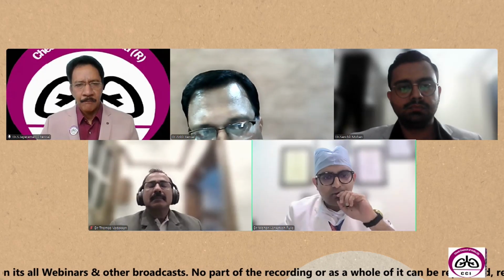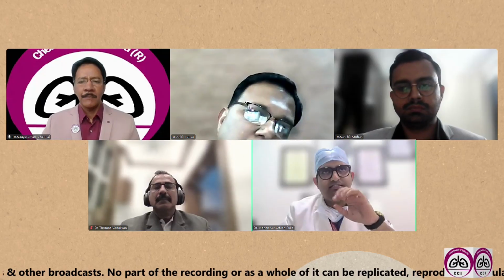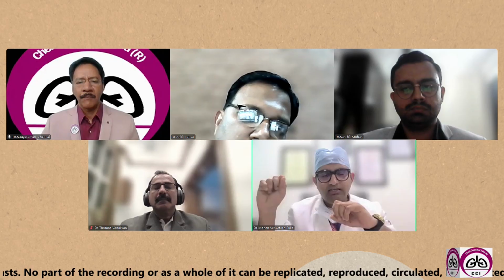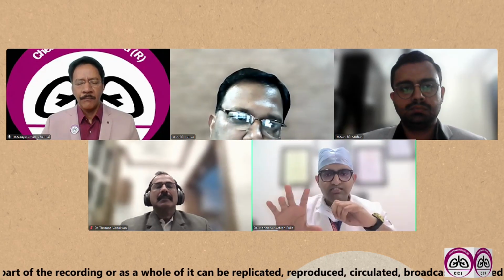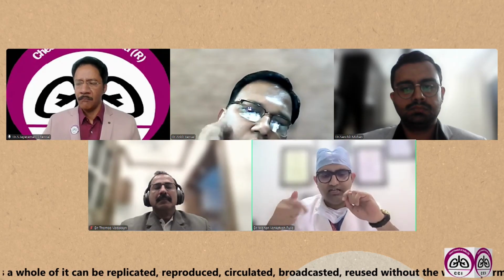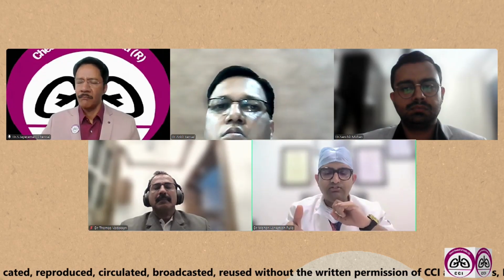It is an avid lymph node, but the size of the lymph node is smaller. In those situations, because the size of the lymph node is actually proportional to the yield in EBUS, the smaller the size, the greater the possibility of not getting the tumor, not getting an adequate sample. The sensitivity actually comes down if the size of the lymph node is less. So that is a situation where I would go for mediastinoscopy.